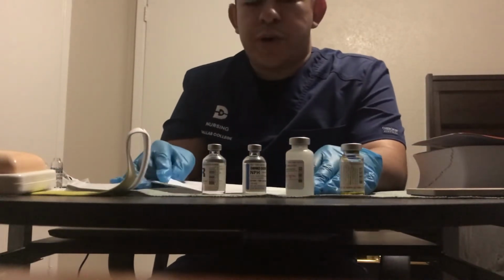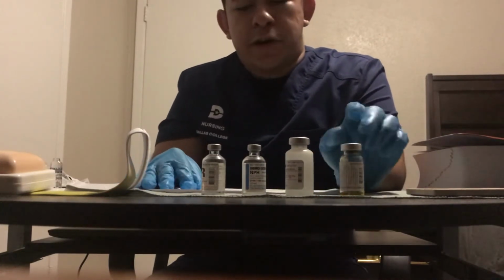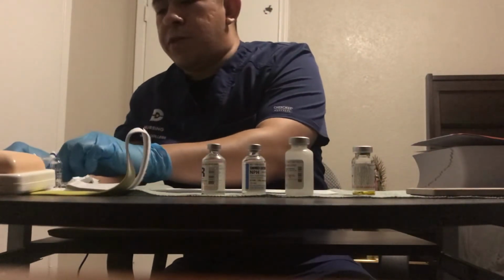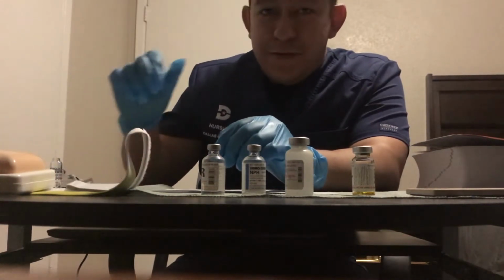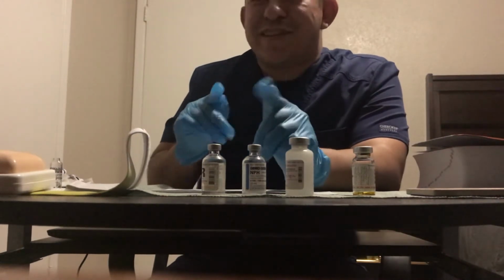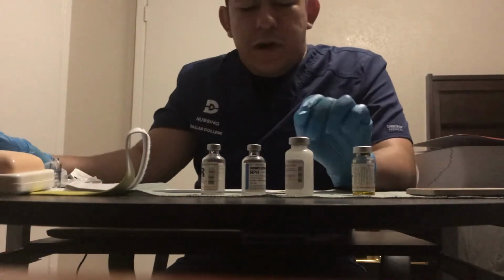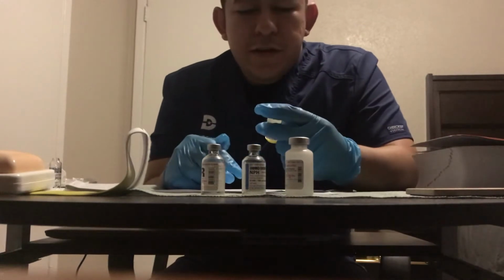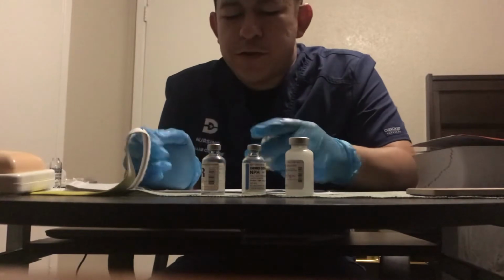So we're going to prepare our medications now. The first one we're going to prepare is our ceftriaxone. Now, you'll have to excuse me because I accidentally blocked the safety on the only needle I have, but I will verbalize what I am doing. So, for our ceftriaxone, we're going to do our second check as we prepare it. Second medication check. This is indeed ceftriaxone, 1 gram for Jack Buzzard.